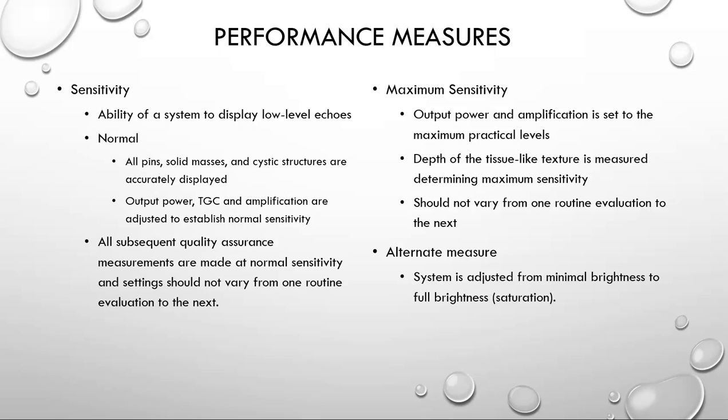When the output power, TGC and amplification are adjusted to a normal sensitivity, we would see normal sensitivity. All subsequent quality assurance measurements would be made at this normal sensitivity, and the settings should not vary from one routine evaluation to the next.